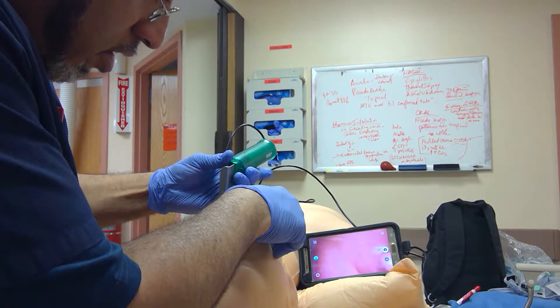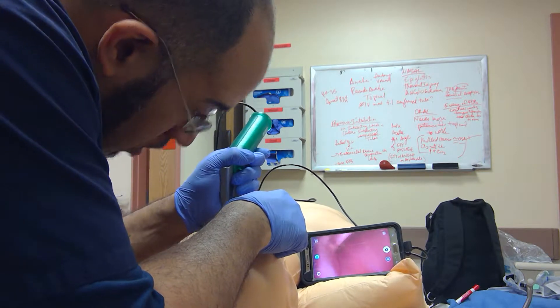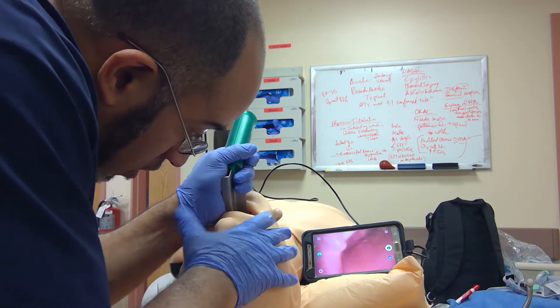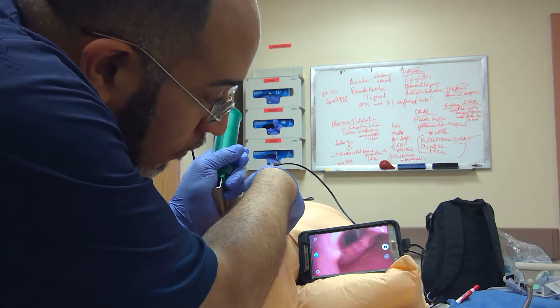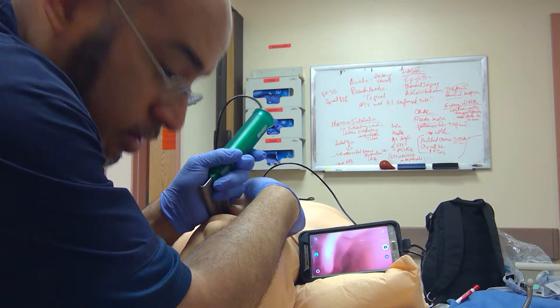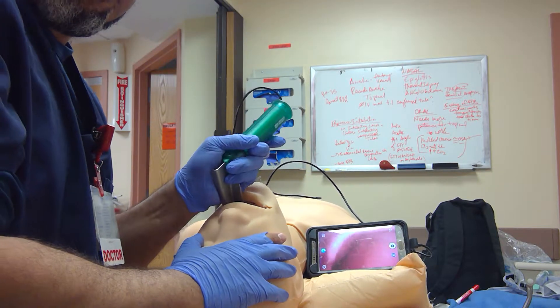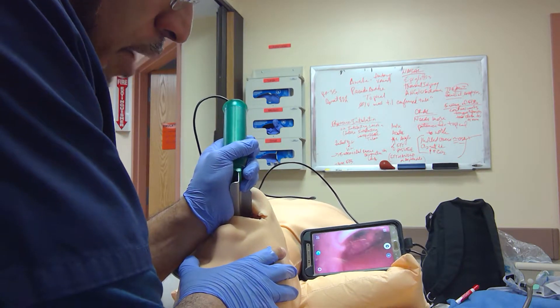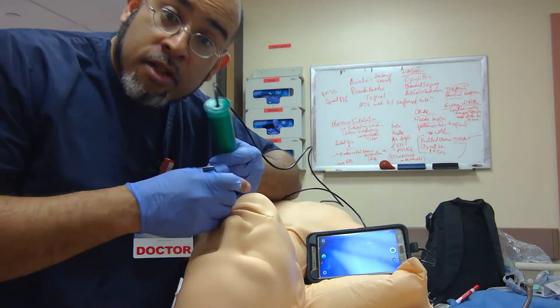Follow the path and hopefully you'll be able to see what I'm seeing. My traditional sweep — my uvula — going to the base of the tongue, trying to identify my epiglottis. I see it — epiglottoscopy — I can see the glottis deeper. I'll try to manipulate the view, though in this case it makes it a little worse. I get my view, introduce my tube, and pass the ETT with the stylet. It doesn't seem so hard.